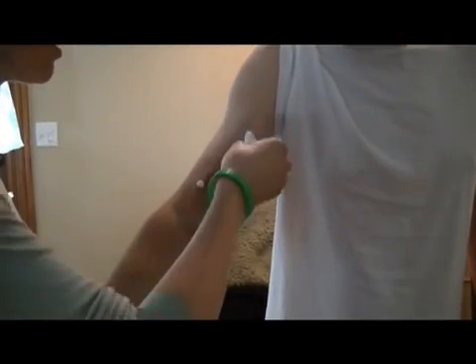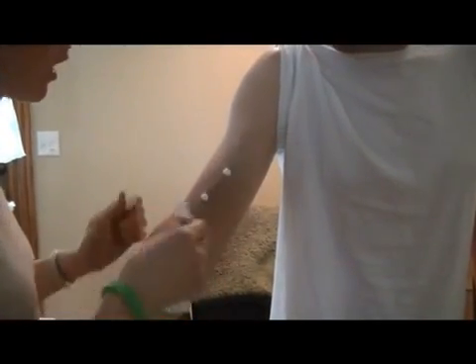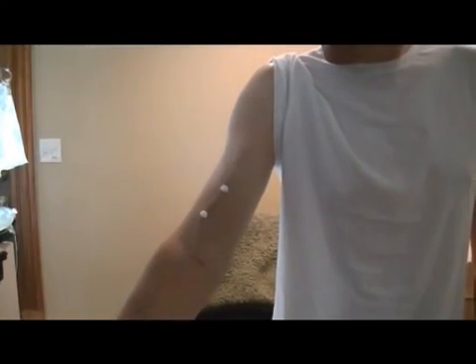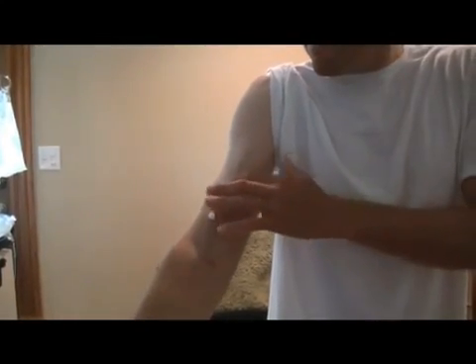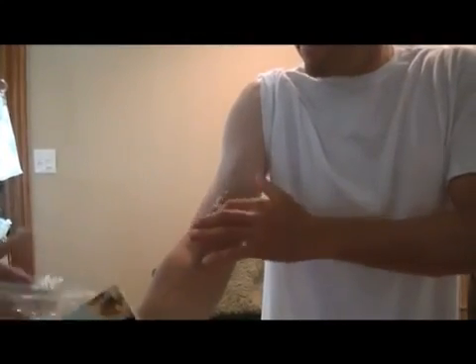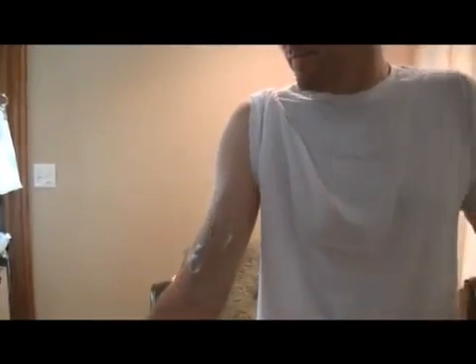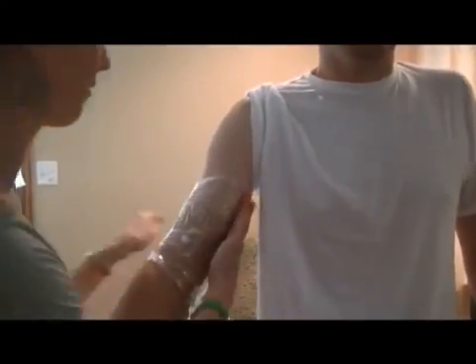First we put on this lidocaine cream, and it has to set for 45 minutes so that it doesn't hurt as bad whenever we put the needles in. And we wrap it in saran wrap and let it wait, like I said, for 45 minutes while we set the machine and everything up.